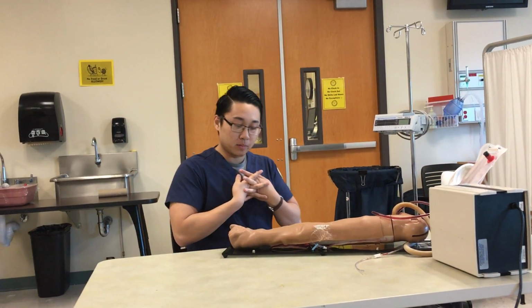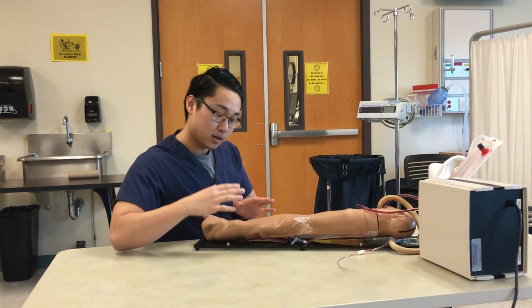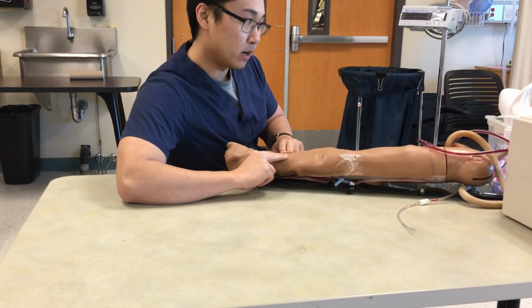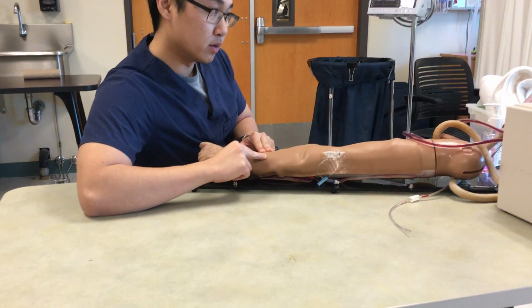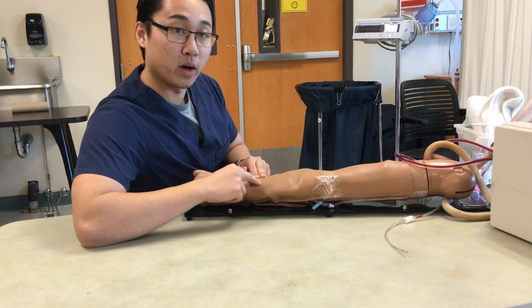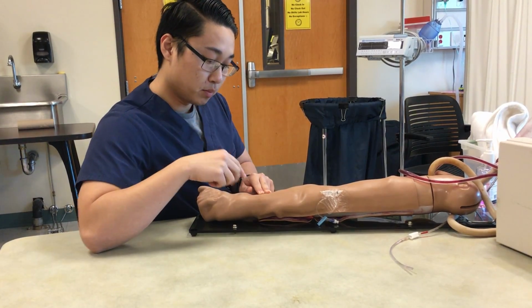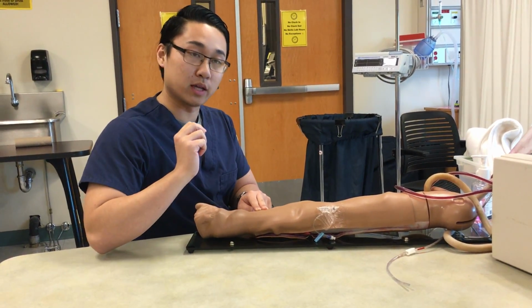Alright, now I'm going to do the Allen's test. So how I do that is I will cover the radial artery and the ulnar artery, and I'll have the patient open and close their hand until blood goes away from the palm and it turns white. Once I take off the pressure of the ulnar artery, blood should rush back to the palm within 5 seconds or less.